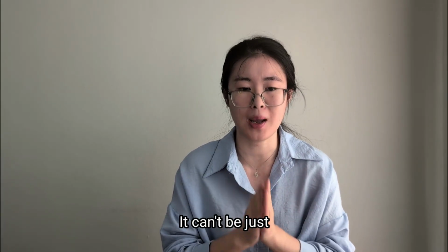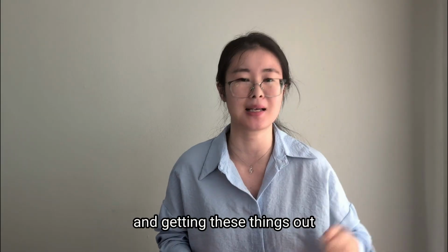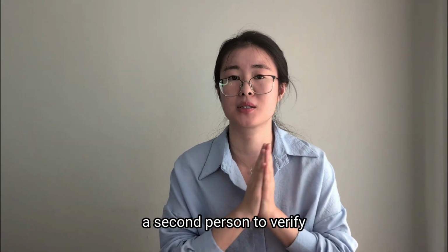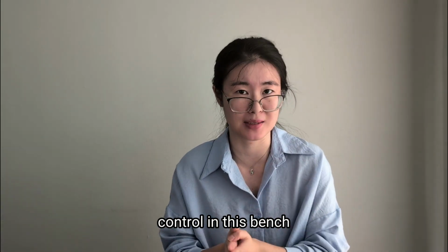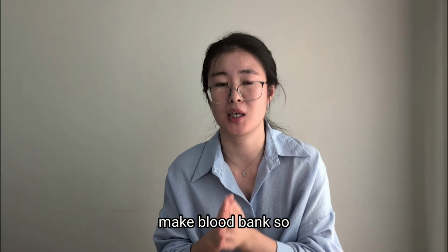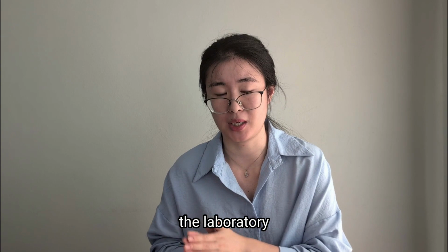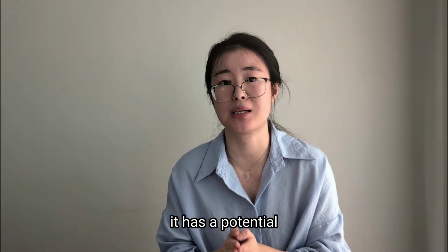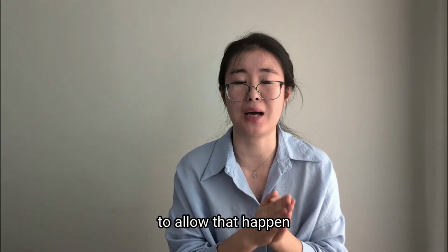It can't be just one person sitting there being like, boom, stamp it, getting these things out. That's not happening. You need to have a second person to verify. The amount of safety control in this bench is crazy. This is something that makes blood bank so different from all of the other benches in the laboratory. Any wrong product going out from here has a potential to instantly kill someone. So we are not going to allow that to happen.